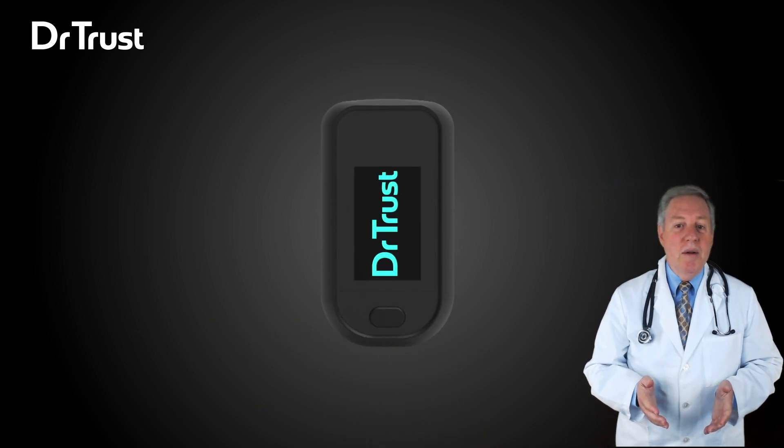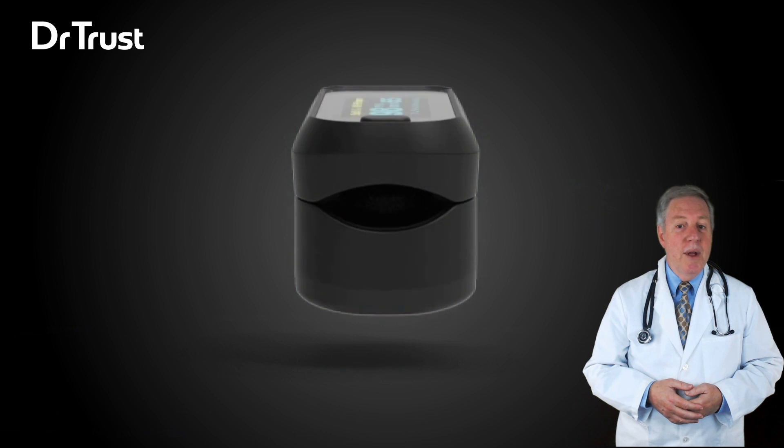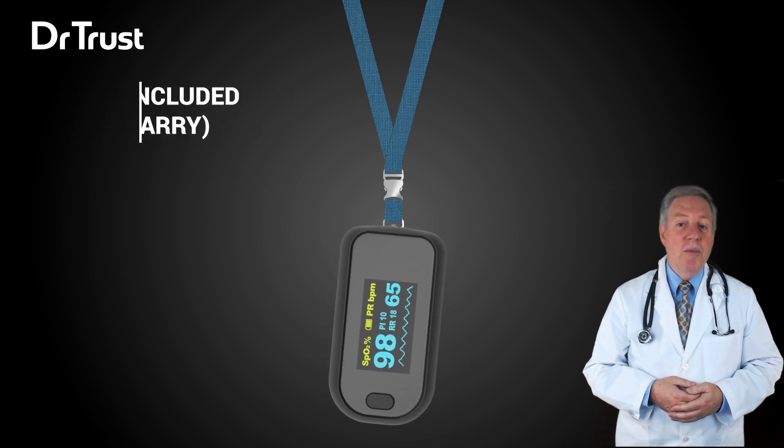Read the corresponding data from the display screen. The product will automatically be powered off if no finger is detected for more than 16 seconds. The product is lightweight for carrying and easy to use, and comes with a lanyard.